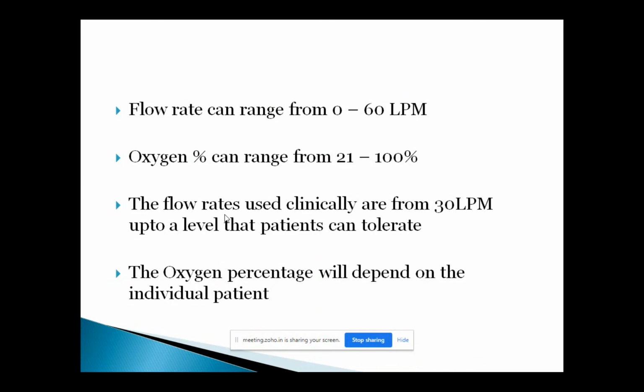If the patient is on oxygen therapy for 5 days, you may start the patient on nasal cannula for the first few days. If they're not responding, then you may go to a face mask or a non-rebreathing mask. But with this device, you'll not keep changing the device. One device is set on day one, and the same device is taken off when they are ready to be discharged home or when they are clinically better, because you're just literally stopping the machine and taking the oxygen off, which is the nasal cannula off. You can go up on oxygen, you can come down on oxygen, you can do a lot of variation with one device. You're not wasting many equipments.